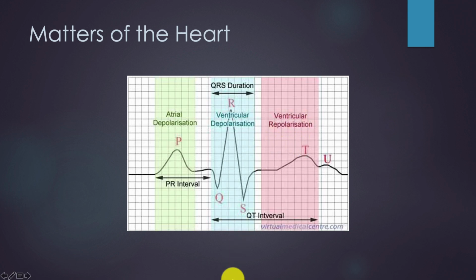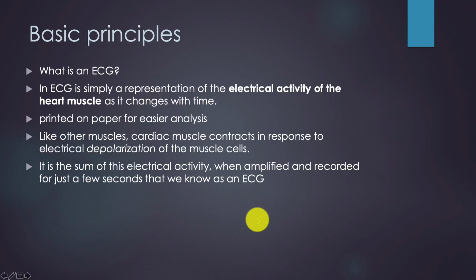So we're gonna kind of go into how this is formed. I'm going to tell you about the mechanisms that form this on an ECG or EKG machine. We're going to talk about how this looks in a normal, healthy heart, and then we're going to talk a little bit about how in a dysfunctional heart where we have discoordination, such as AFib, all of this is going to change.